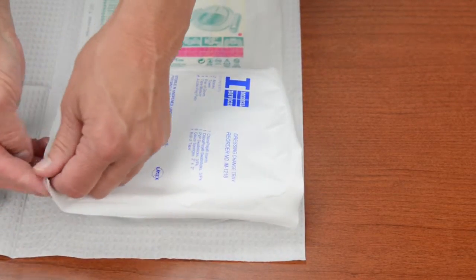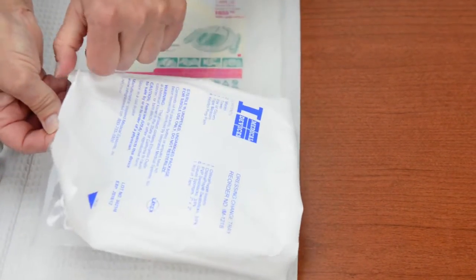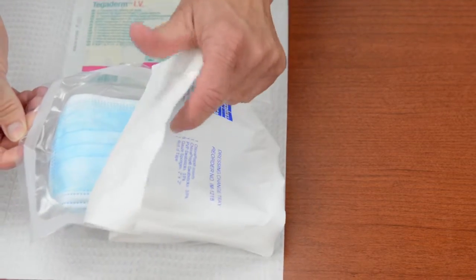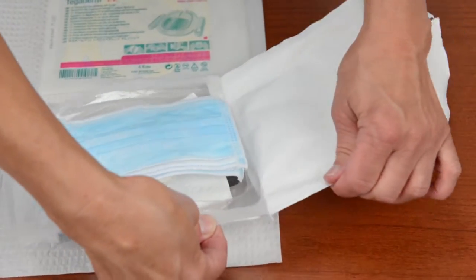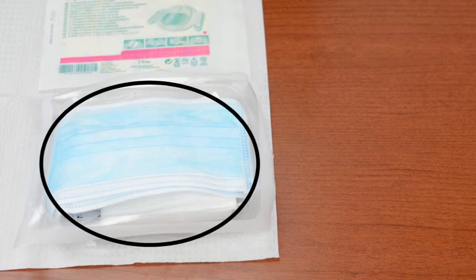Next, lift the corner of the paper cover on the tray of the bandage change kit. Carefully peel the cover to remove it from the tray and put the cover into the trash. The inside of the tray is a sterile area. Do not touch the supplies in the tray with your fingers or anything that is not sterile.